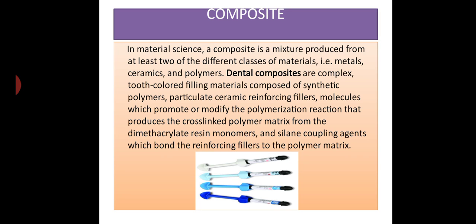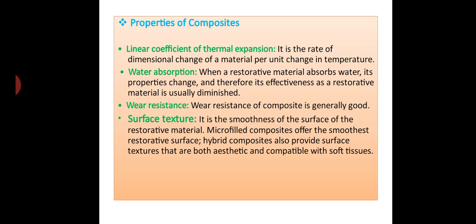Now come to the composite part. Dental composites are complex tooth-colored filling materials composed of synthetic polymers, particulate ceramic reinforcing fillers, molecules which promote or modify the polymerization reaction that produces the cross-linked polymer matrix from the dimethacrylate resin monomers, and silane coupling agents which bond the reinforcing filler to the polymer matrix.